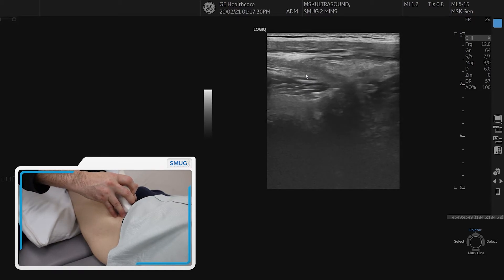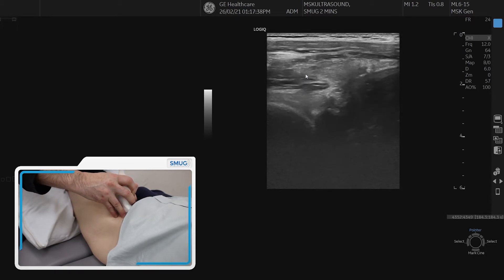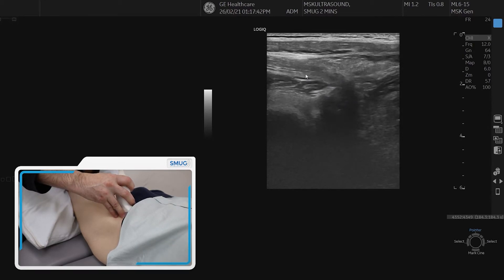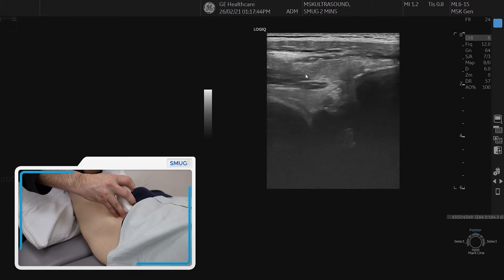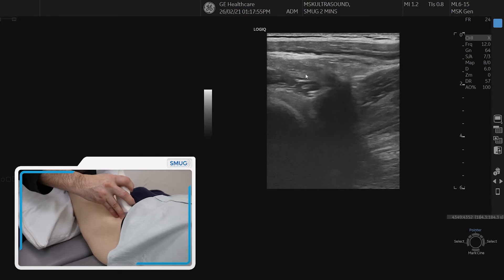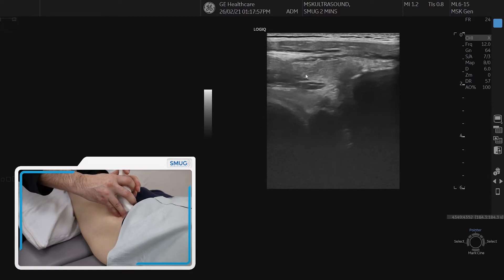Another tip is to put a pillow or a roll under the knee — so there's a little bit of knee flexion, but more importantly hip flexion. Because you have to push quite hard with the probe to get a good image, and it's very uncomfortable for the patient if the leg is fully straight in hip extension. Giving a little bit of flexion in the hip helps make it more comfortable and easier to get the probe position right.